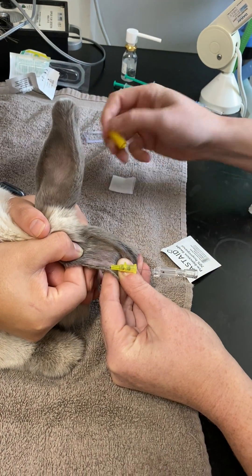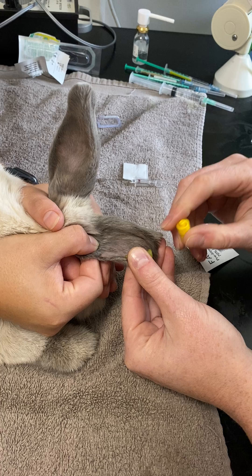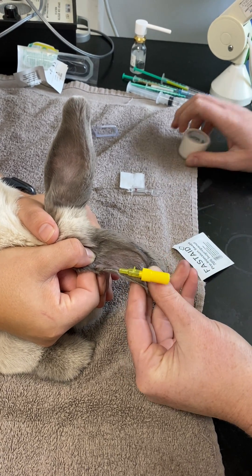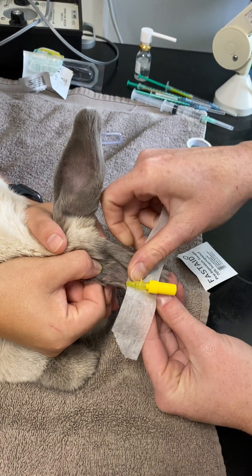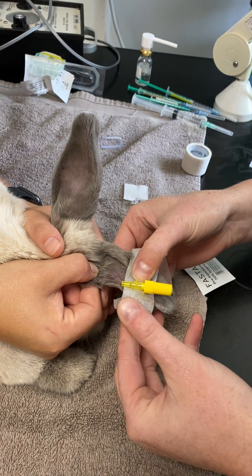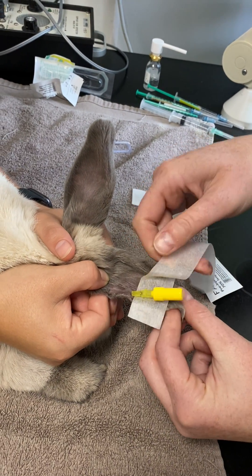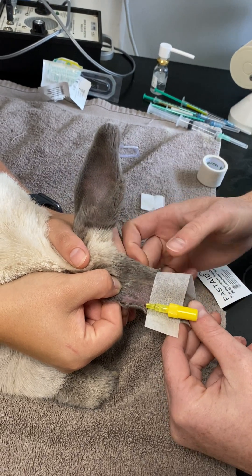Once we've done that we're going to pop a bung on it. I am going to use just two bits of tape — that is it. So the first bit of tape goes underneath and we want to make a little tab on the end, just like this. The rabbit's ear is going to naturally fold, so you don't want to squeeze it over that fold.